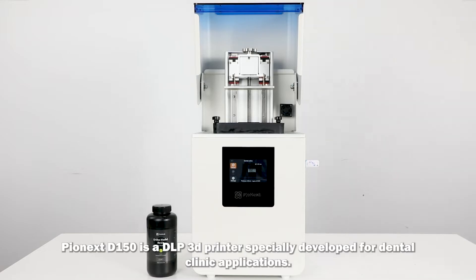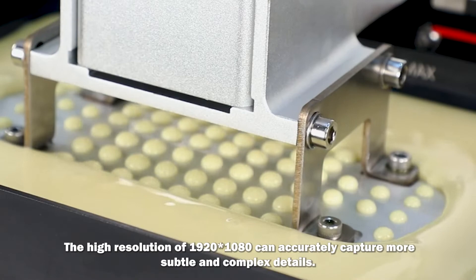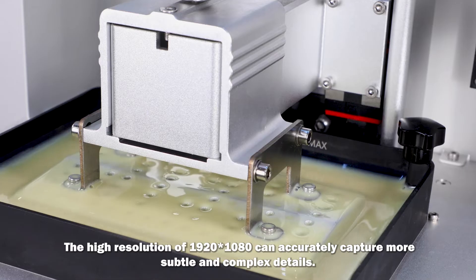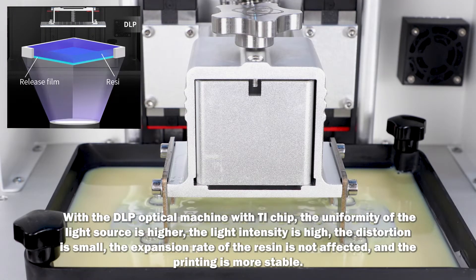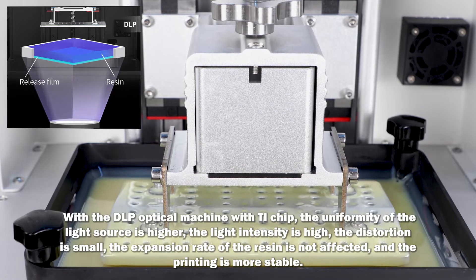Pionext D150 is a DLP 3D printer specially developed for dental clinic applications. The high resolution of 1920 by 1080 can accurately capture more subtle and complex details. With the DLP optical machine with TI chip, the uniformity of the light source is higher, the light intensity is high, the distortion is small, the expansion rate of the resin is not affected, and the printing is more stable.